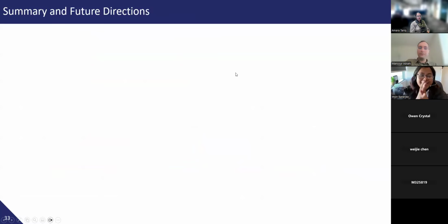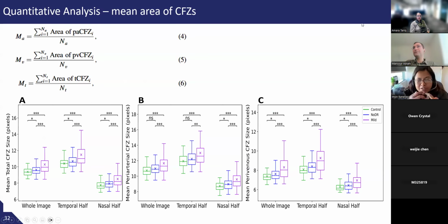So, Mansour, can I ask you one quick thing here? Because you're talking about all these quantitative features, right? I completely agree with you. That shows the statistically significant difference between these three groups that you are targeting. But we still see that there are a lot of overlaps, right? If you look at the 95% confidence interval, you see that there are still a lot of overlaps between these features. Yeah. So your primary target, I think your last comment kind of clarifies it, is to use these quantitative features and feed them to another classification model, right?